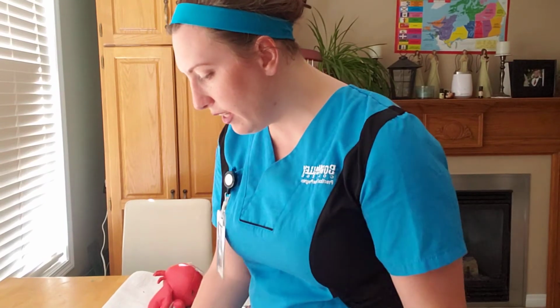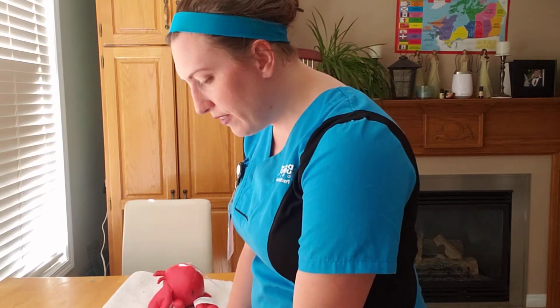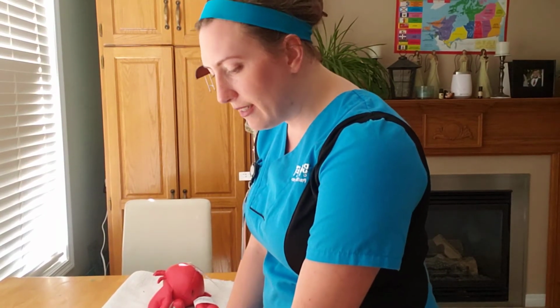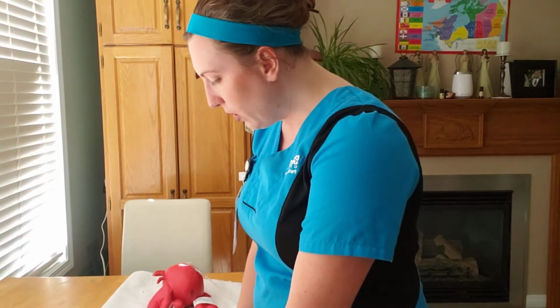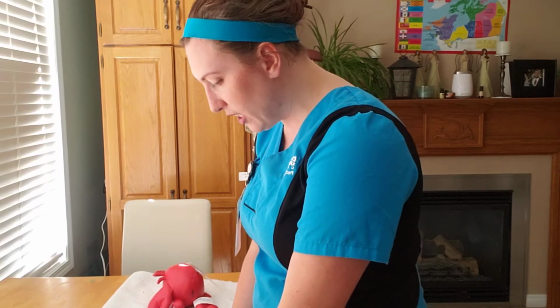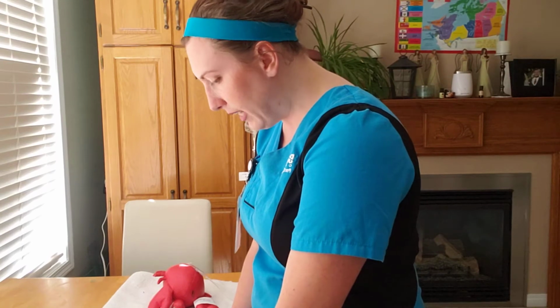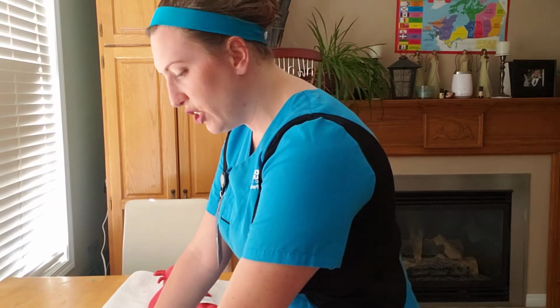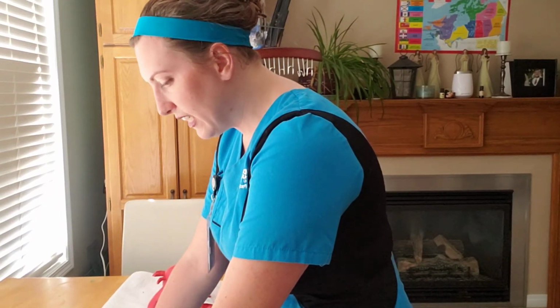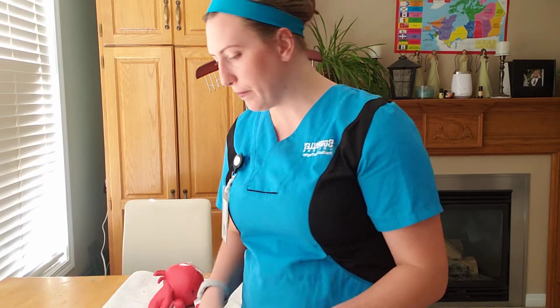Again, on the doctor's order, I'm just going to have a quick look at ranitidine. The ranitidine is 50 milligrams IVPB, which means intravenous piggyback, and OD is daily, and it's to start today. Then I'm going to go back to my MAR for ranitidine. It checks out, same medication at 50 milligrams IVPB. So the route, the medication, and the dose are all consistent, as well as our patient Allison Chinook, ID 614973042. So we're going to be administering ranitidine via IVPB.